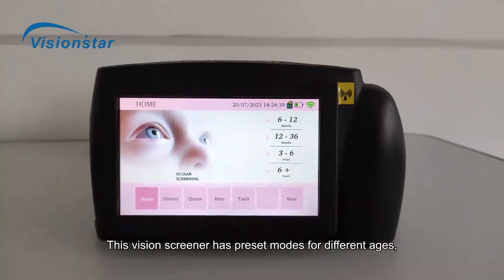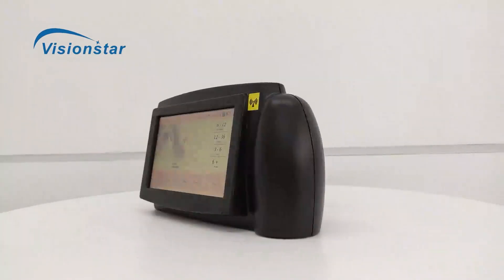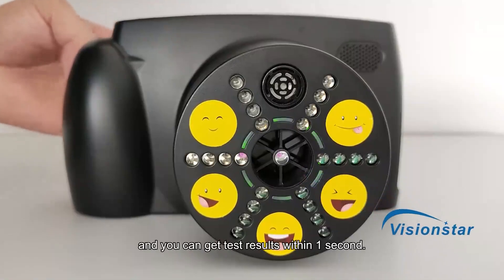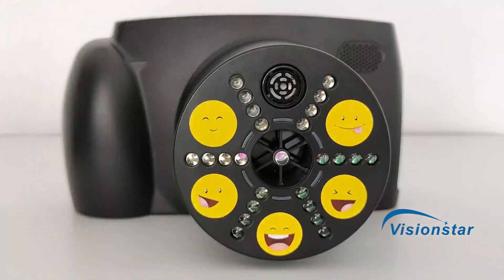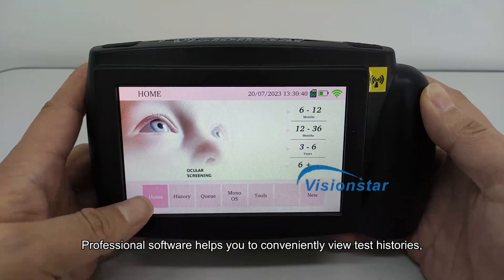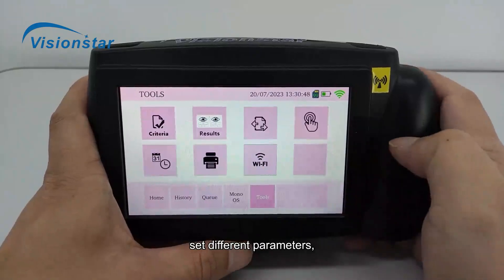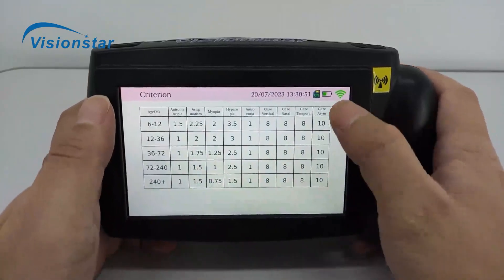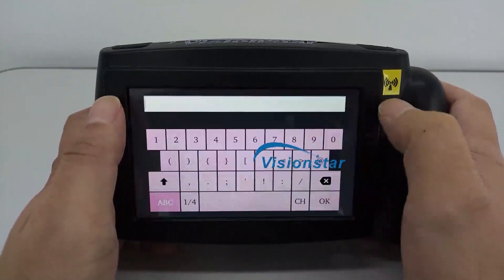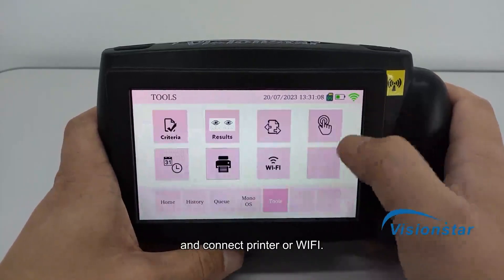This vision screener has preset modes for different ages, and it is suitable both for children and adults. It has an advanced optical system which makes measurement very fast, and you can get test results within one second. Professional software helps you to conveniently view test histories, manage patient queue, choose monocular or binocular test mode, set different parameters, and connect printer or Wi-Fi.